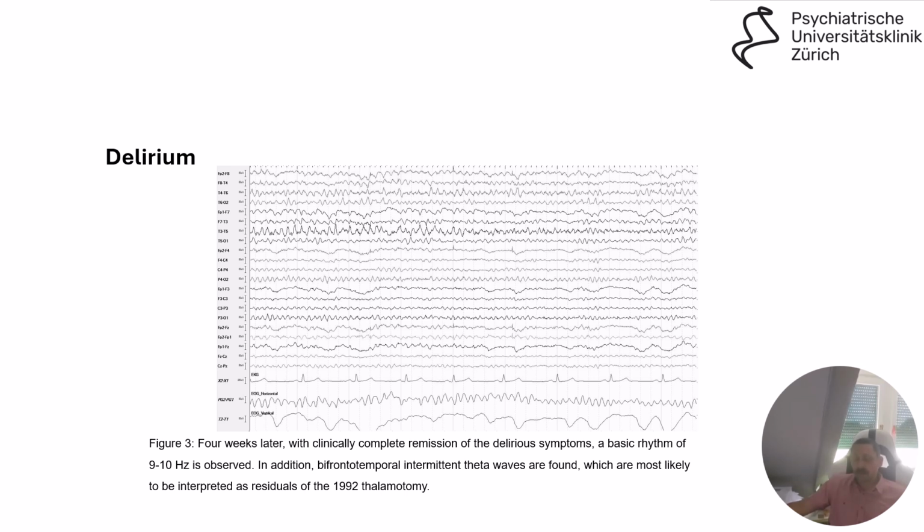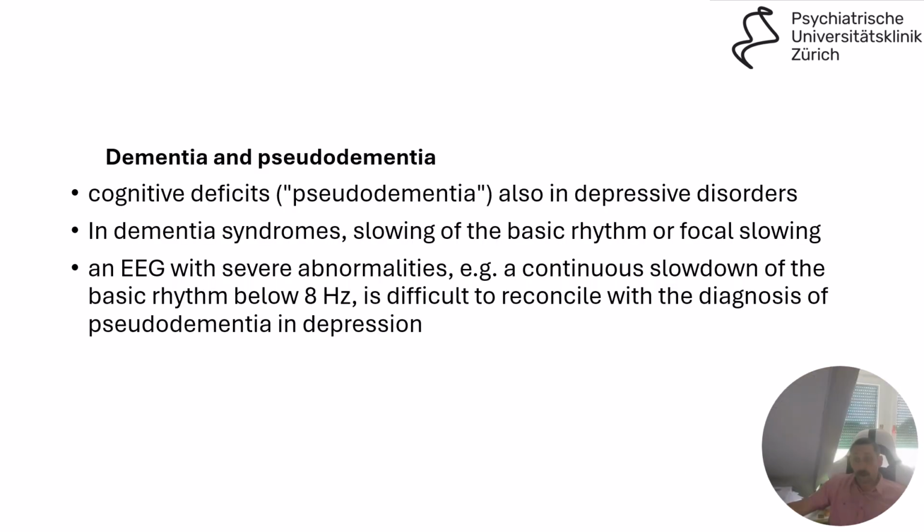So you could differentiate those intoxications by lithium and its effects on the brain by doing an EEG, and then knew that you should maybe try to stop the lithium if this is clinically a good choice. However, this is why you don't treat an EEG by itself, but you always treat the patient, and you gain some additional information from the EEG, but you don't treat the EEG.